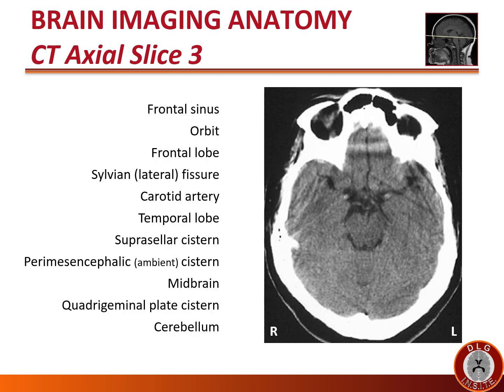We are now one slice higher up. See if you can identify the structures listed on this slide before proceeding. The frontal sinus is an air pocket within the frontal bone — thus it is black or hypodense on CT. At this level we see the orbit above the eye, and we are now able to see the frontal lobe in the anterior cranial fossa.